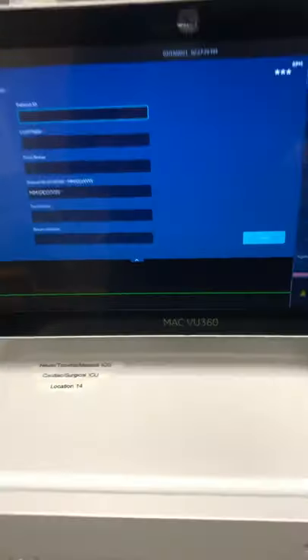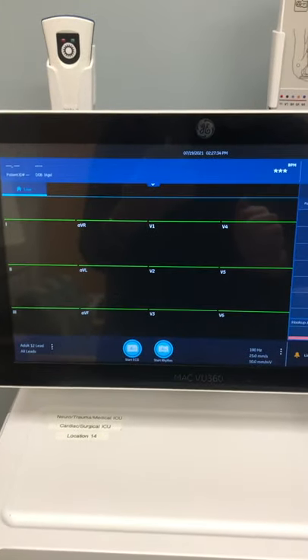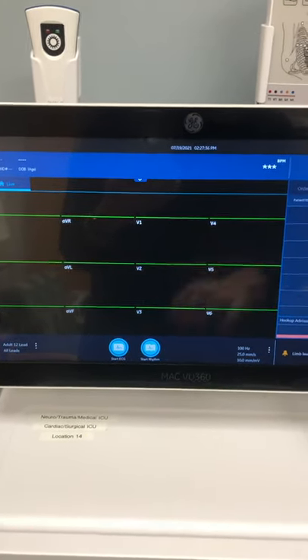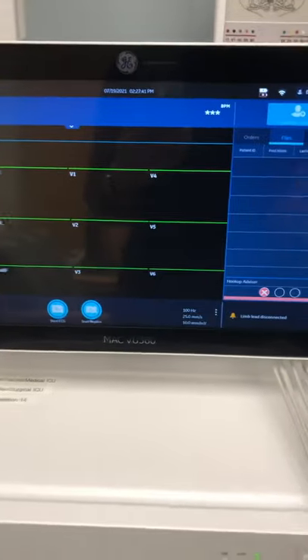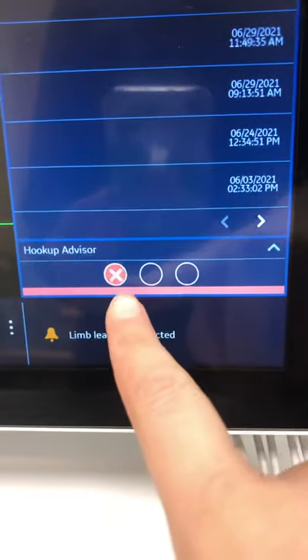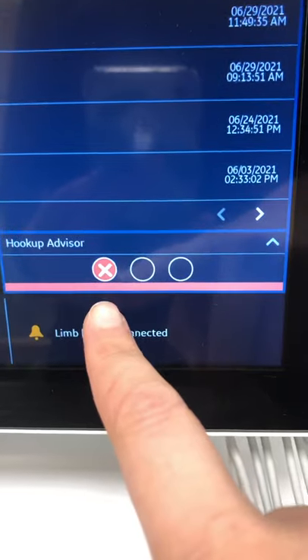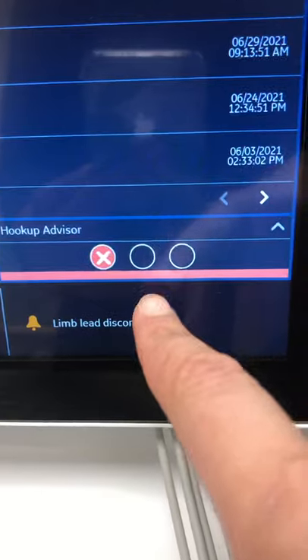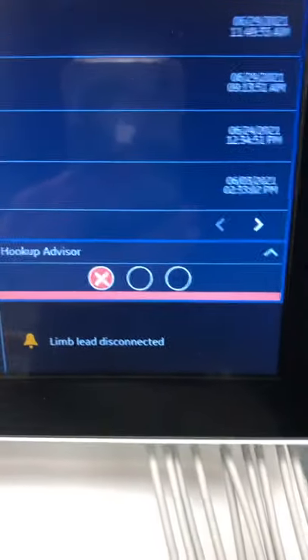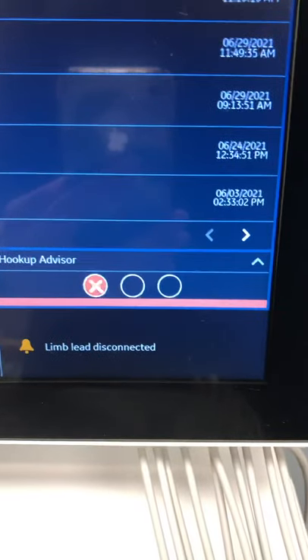Once you put all the information in, hit Save — it brings you back to the main screen. As you start placing your electrodes and leads, you should see waveforms begin to show up. There are three dots at the bottom that indicate signal quality. Right now it shows a red blinking dot. If your electrodes are in the right place, it will go from a red X to a yellow dash to a green check mark. A green check mark means you have the best picture and the machine is advising you to take the EKG then.